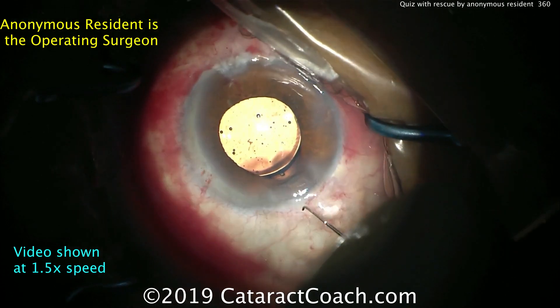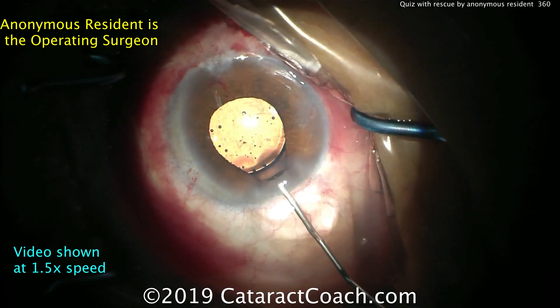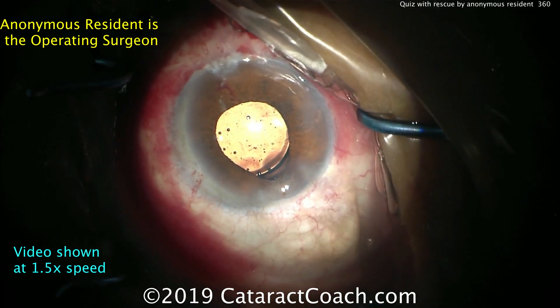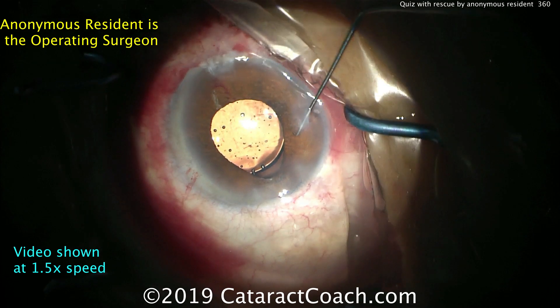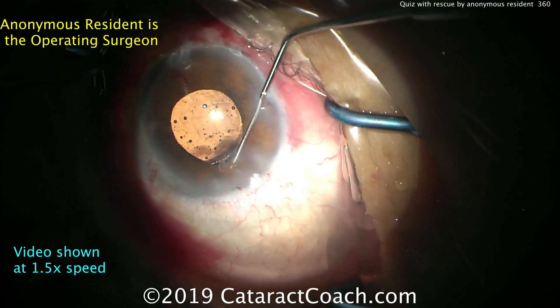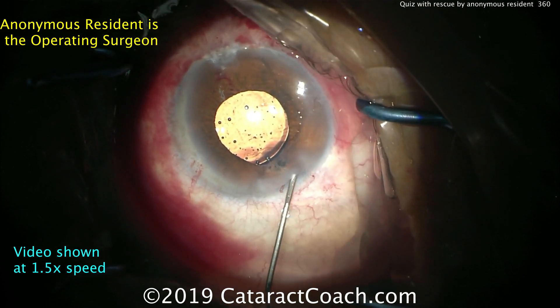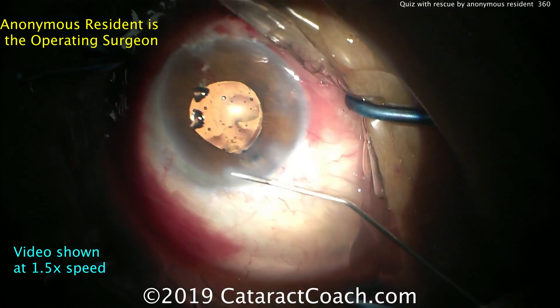If the lens is in the correct orientation, the optic angles a little bit posteriorly behind the iris, so there's still an acceptable gap and aqueous can flow through the pupil. However, if you put the lens in the eye backwards — upside down — the angulation goes the wrong way, and the IOL optic will be forced up against the back surface of the iris, giving you basically a pupillary block. You definitely do not want this lens in upside down.